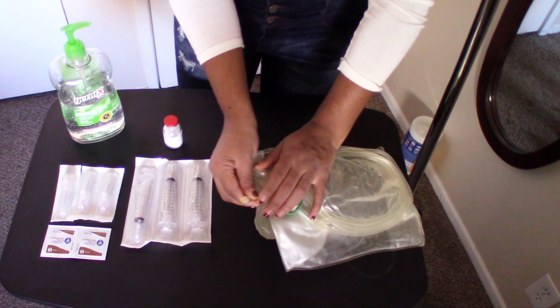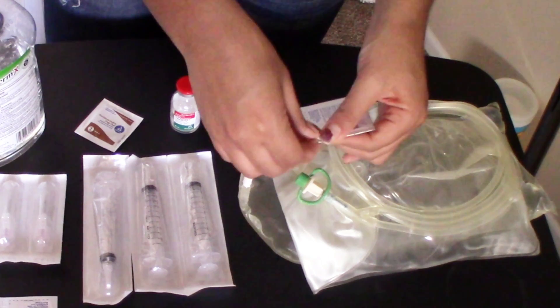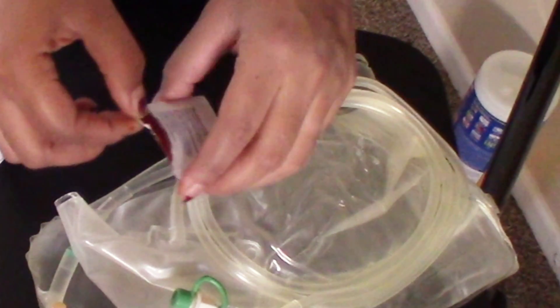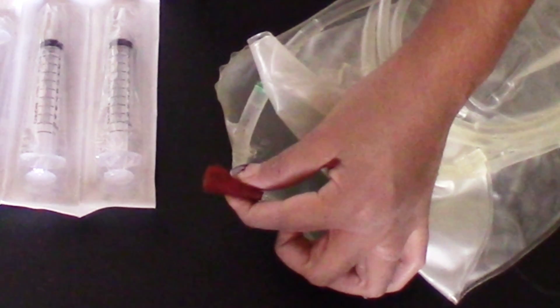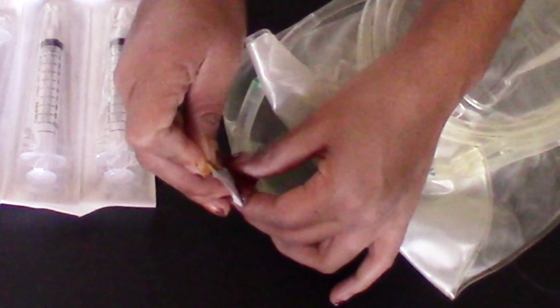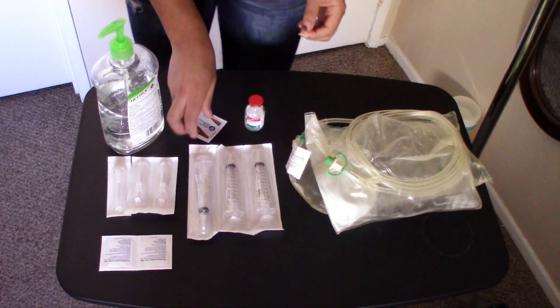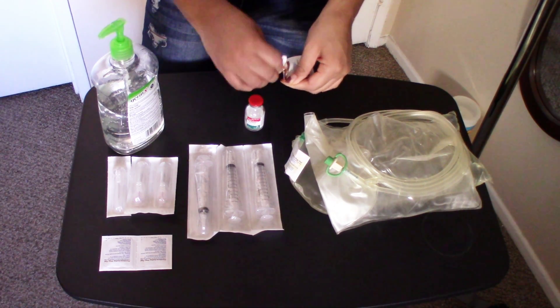We're going to flip the manual over to where you have a clear way to the medication port. Now grab the prep pad. I have a little trick: I open the pad as wide as I can, wrap the medication port with the Povidone pad, then just snuggle this baby right back on. The second Povidone pad will be used on the vial.